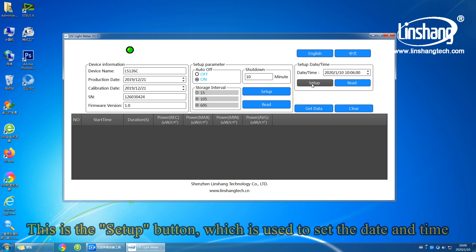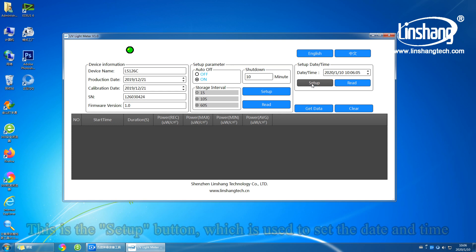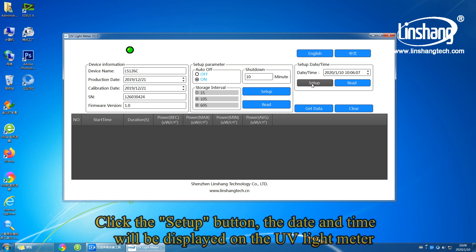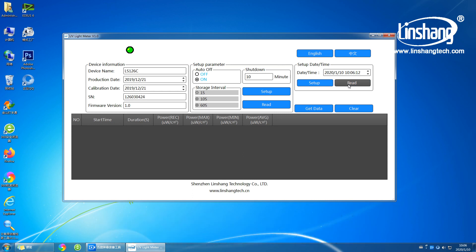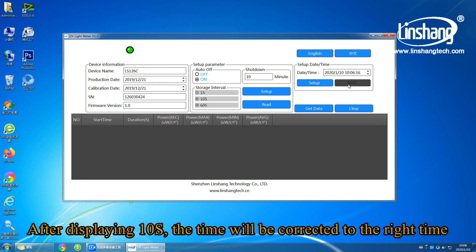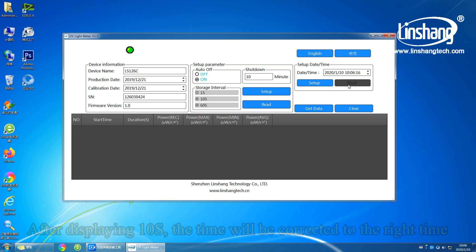This is the setup button which is used to set the date and time. Click the setup button and the date and time will be displayed on the UV light meter. After displaying for 10 seconds, the time will be corrected to the current time.